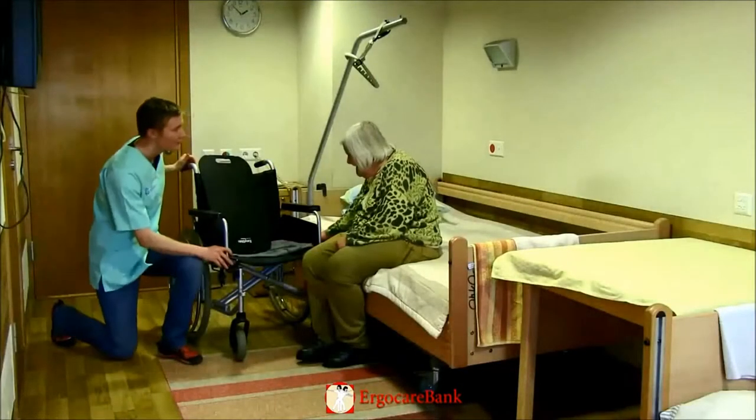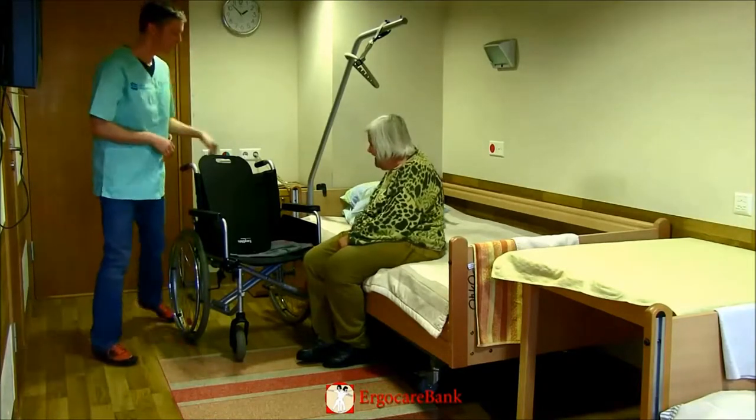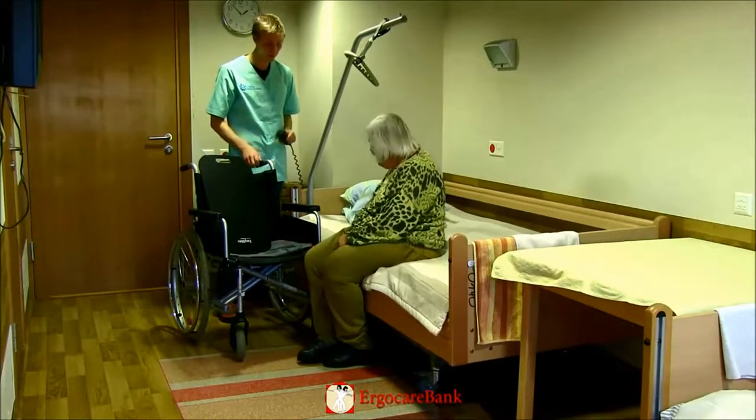The staff member prepares the transfer by angling the wheelchair to the bed, putting the brakes on, and raising the bed so that it is higher than the seat of the chair.